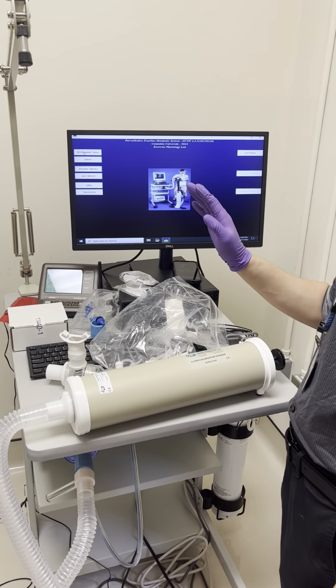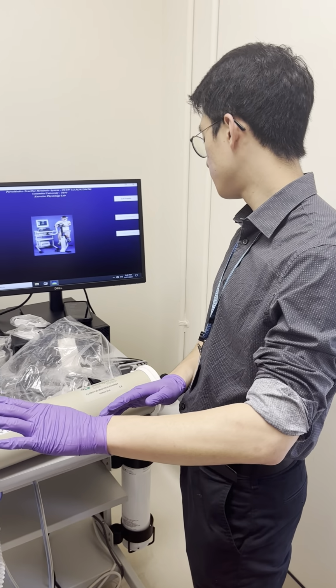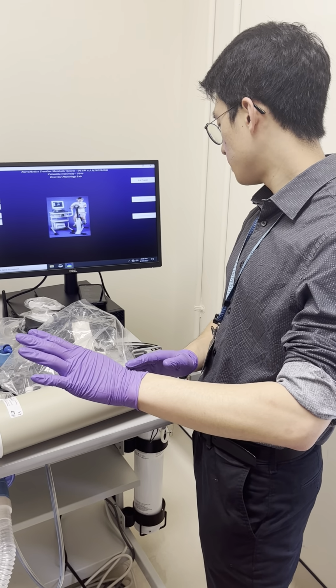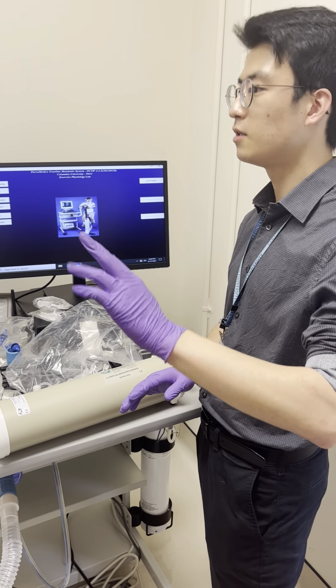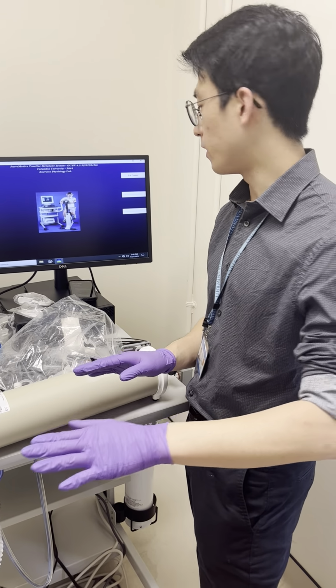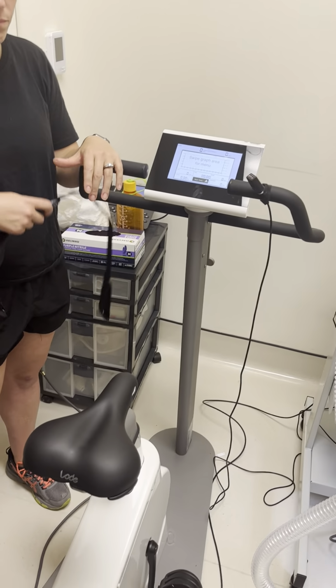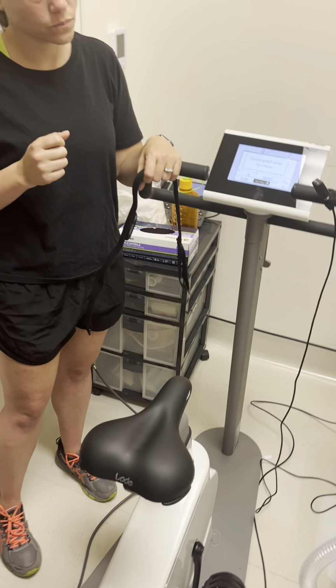Okay. So make sure you explain the test to the person before you actually do anything. Are you guys gonna measure height and weight? We've done that, yeah, in the morning. Height and weight have been done already, so make sure you have that information. Seat height. Let's move this right here.